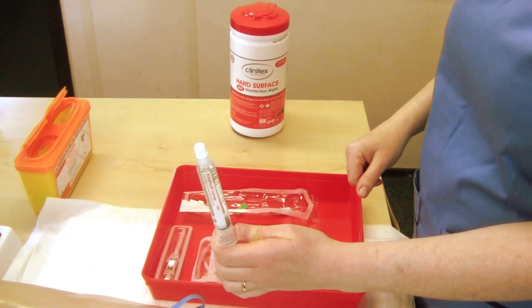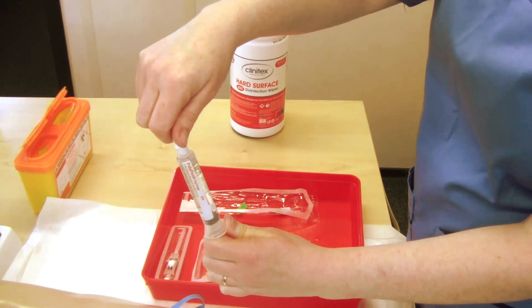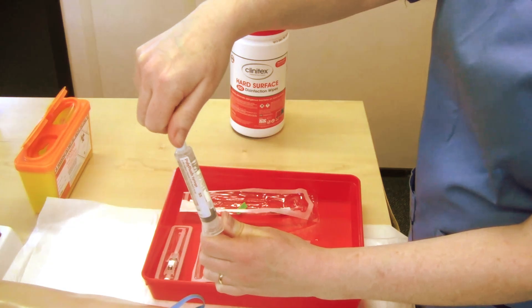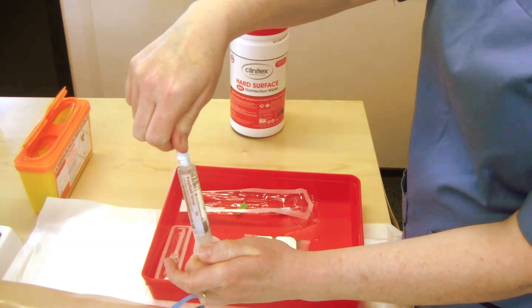When preparing the pre-filled syringe, please follow the manufacturer's instructions. This may include loosening off the plunger by pulling down, twisting the cap, and expelling the air within the syringe.